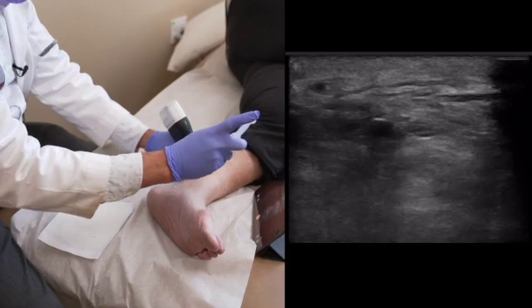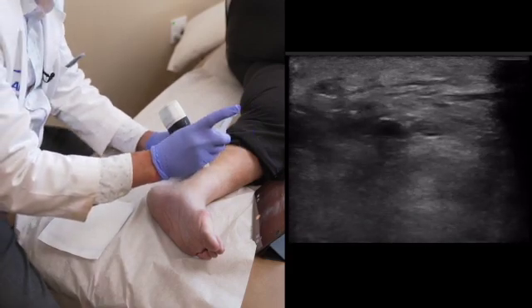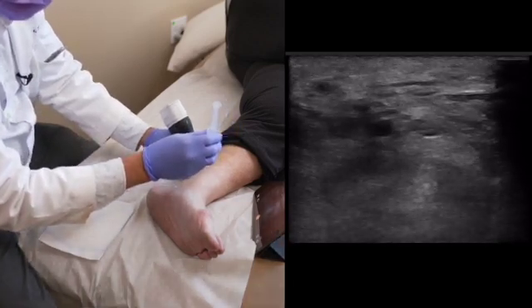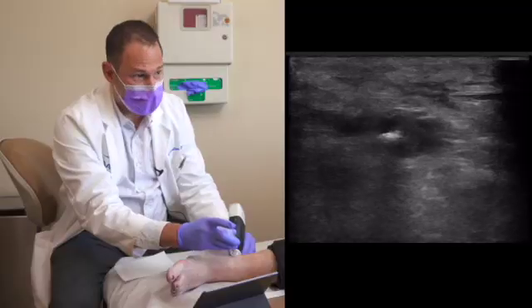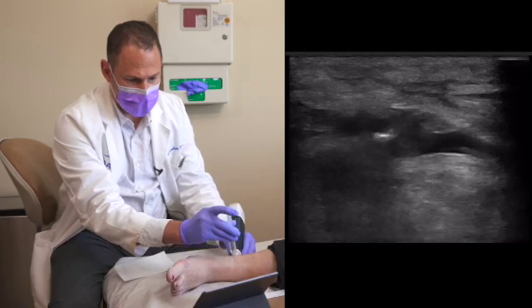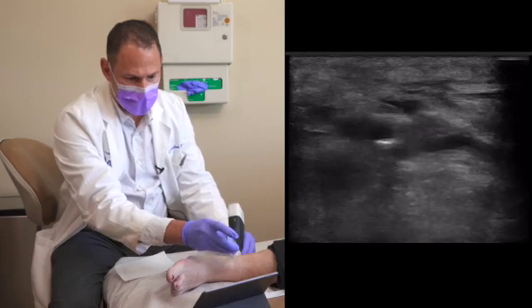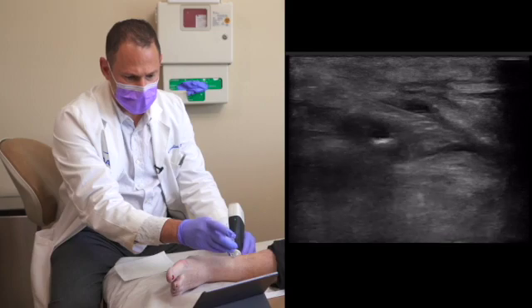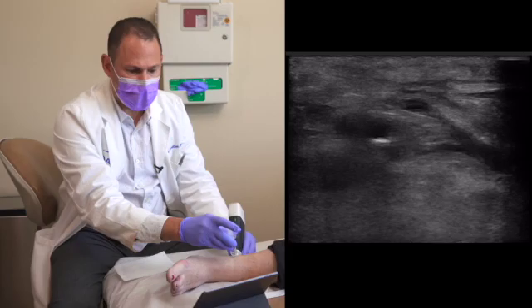We're going to give her a little vapor cooling spray for skin anesthesia, and then a little pinch. As you see here is my needle — it's surrounding the nerve. The black around the needle is the local anesthetic.